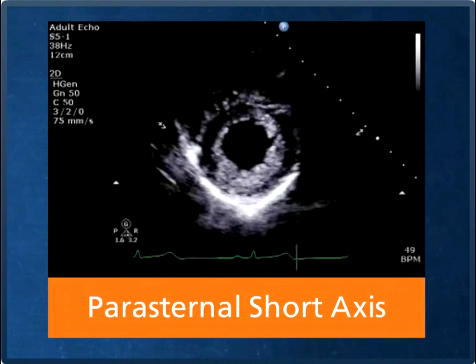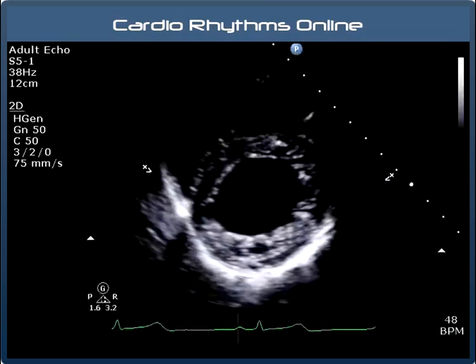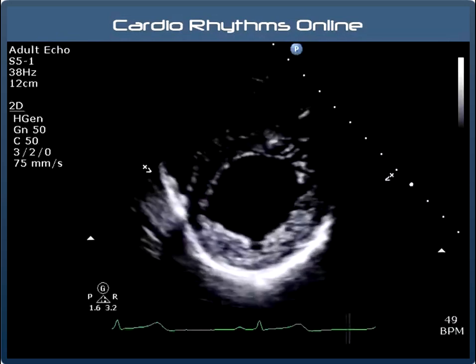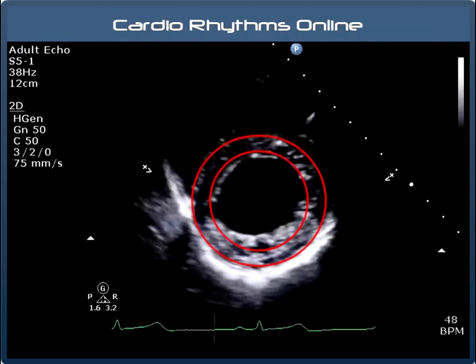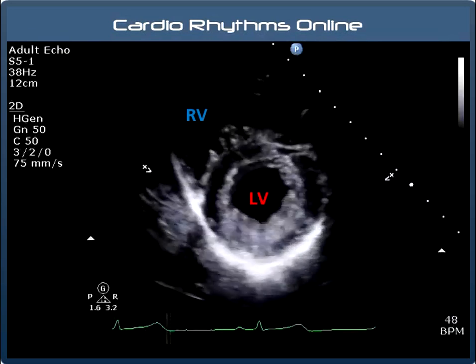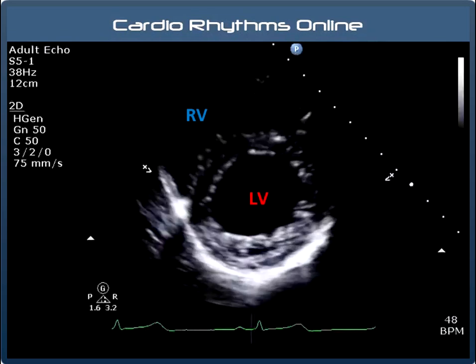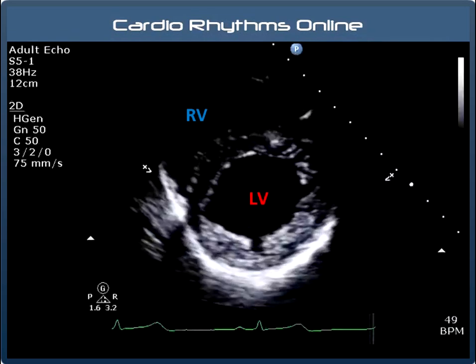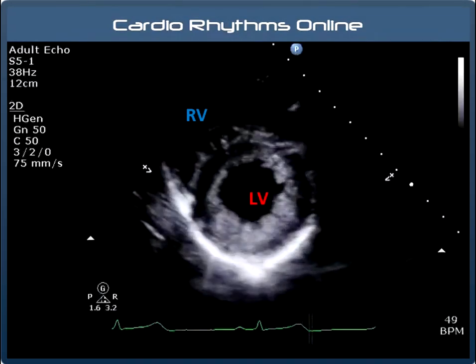The transducer stays where it is, but now we angle the beam downwards to view the left ventricle. We angle the transducer progressively through mitral valve level, mid ventricular level and then at apical level. If you have your angle correct, the left ventricle ideally will appear circular in shape. Here is the main left ventricular cavity and here we can see the right ventricle. This is the best view for assessing the various regions of the left ventricle and assessing LV systolic function. It is also very useful for checking regional wall motion abnormalities — for example, after a heart attack a patient may have regions of hypokinesia or akinesia.